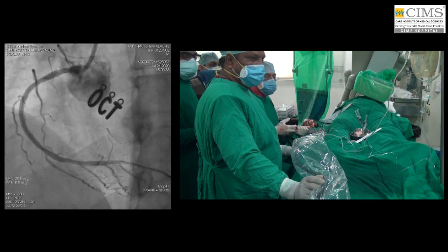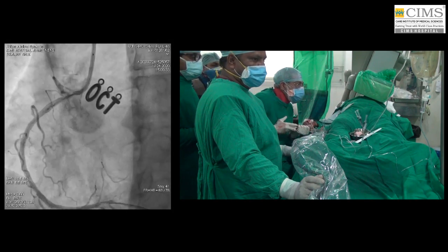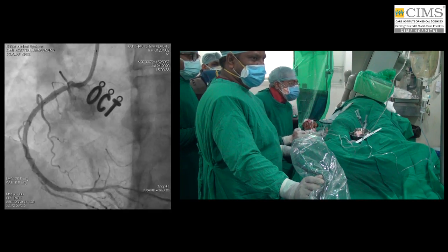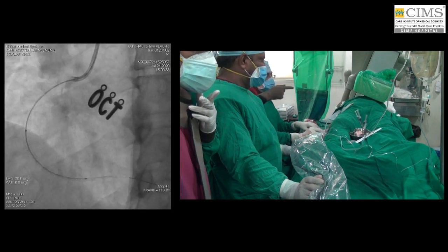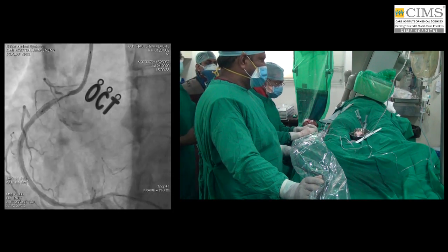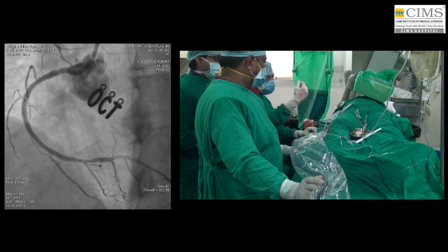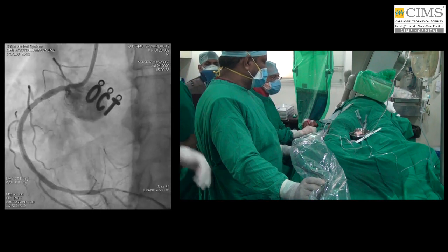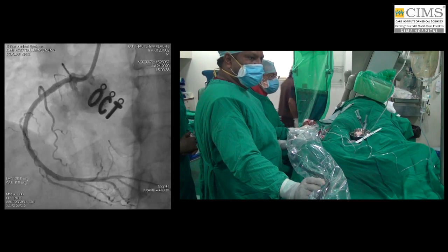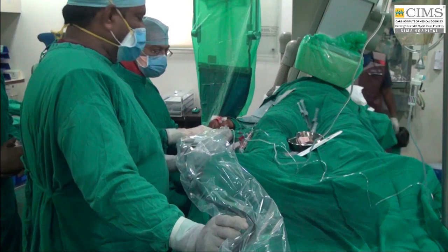So what are the things you see in an OCT after implanting a stent, Dr. Keyur? What we see after the stent implantation in OCT is multiple things. Starting distally, we see edge dissection. Now, let me caution everybody that edge dissection is increased.